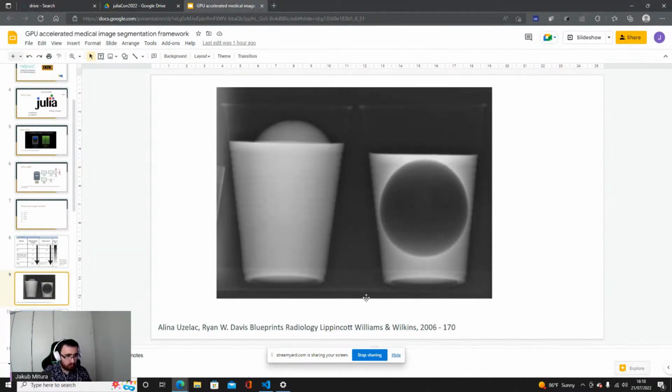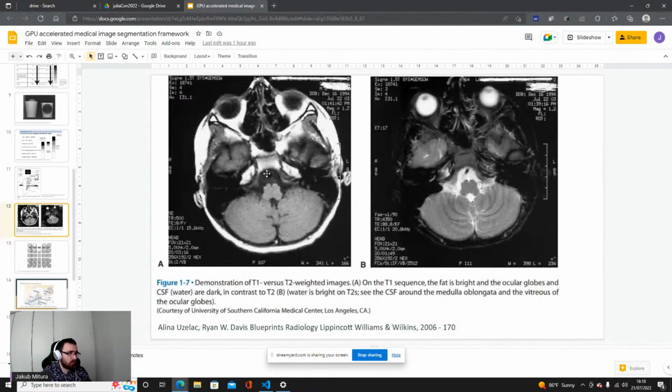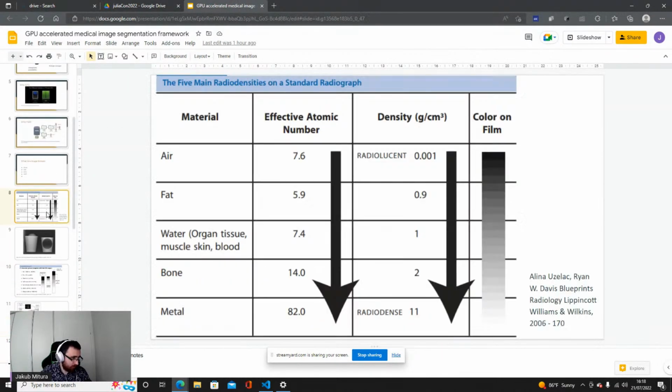So when you look, for example, at this rectangle, you can say that in this place a lot of X-rays get through, and in this place not much. So we have a map of physical properties of this glass. The same is true of the body. This is a map of some physical properties. A different study will mean different properties, but the idea is still the same.